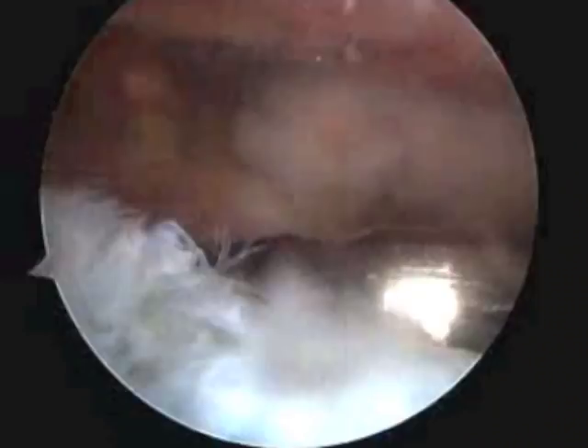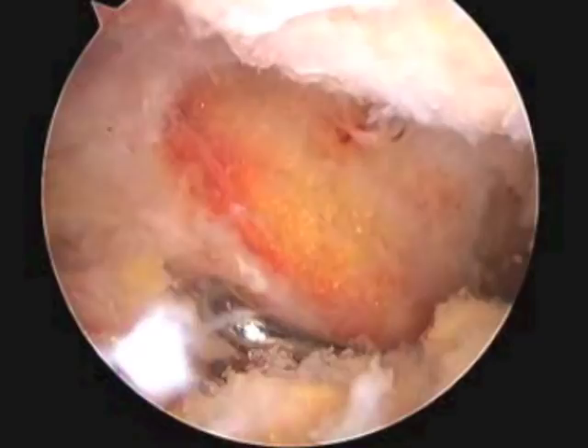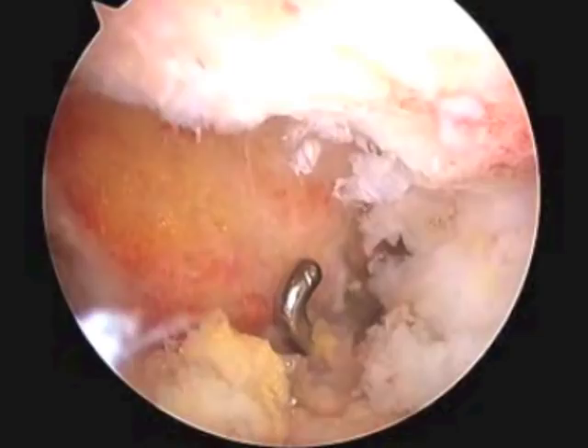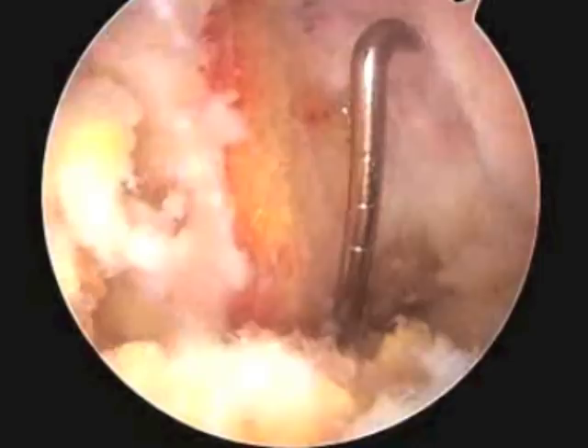We're looking at the acromion top right again, and this little probe here has been brought in just to show you the end result. That's the end of the collarbone — you can see the raw bone where bone has been removed, and again I'm getting my assistant to bounce it up and down. You'll see the probe coming in at the front and now at the back of the collarbone. As we turn the camera up and look to the top of the joint, you can see the white substance just above my probe — that's actually the superior ligament of the joint, which we've left intact.